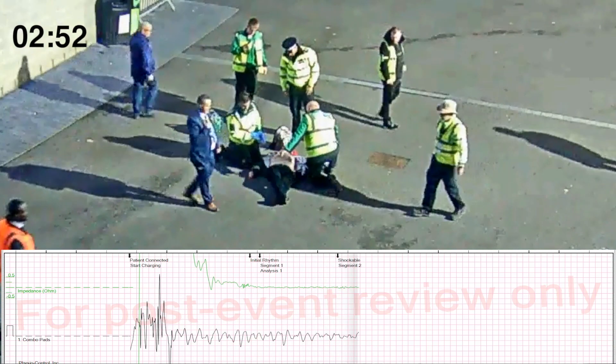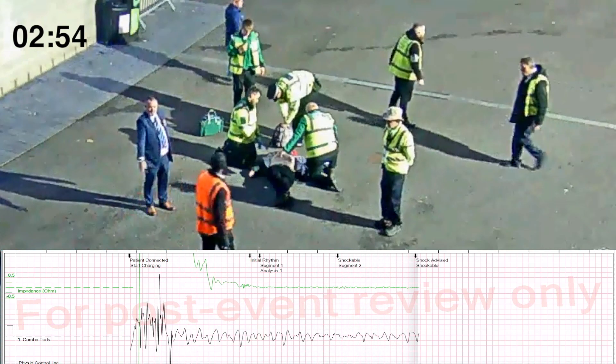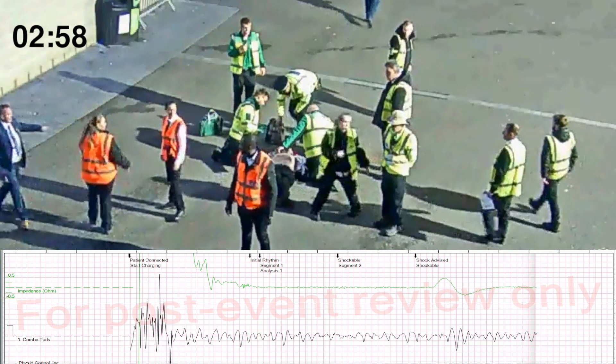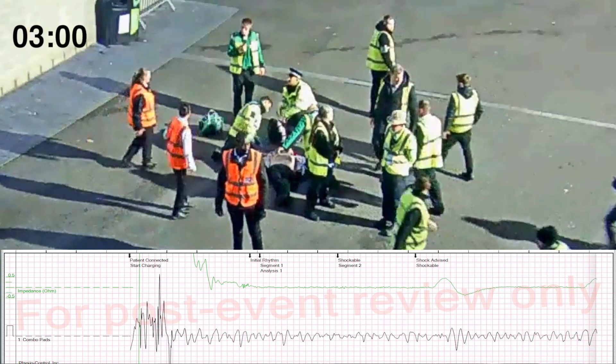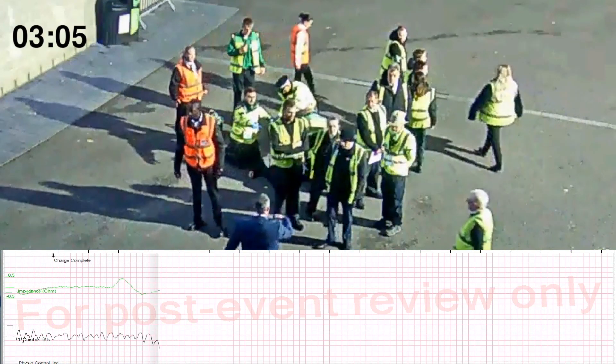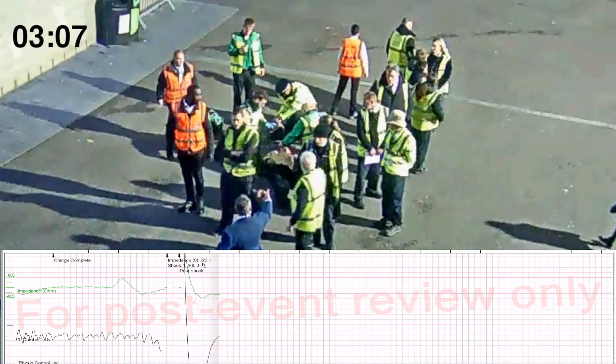Analyzing heart rhythm. Everyone clear. Press flashing button. Shock delivered.